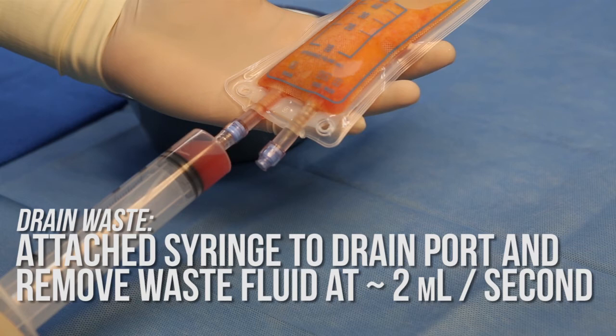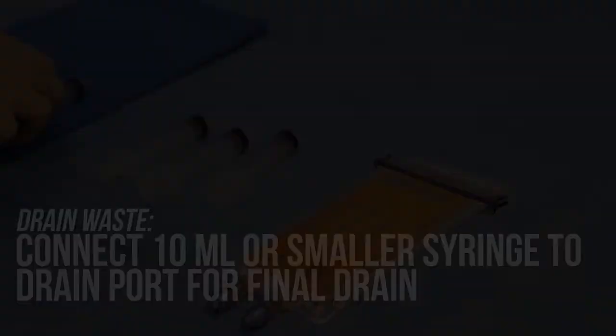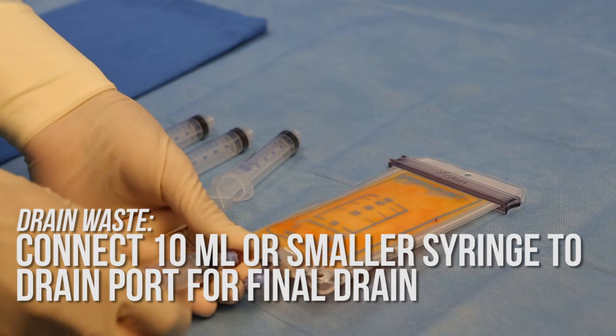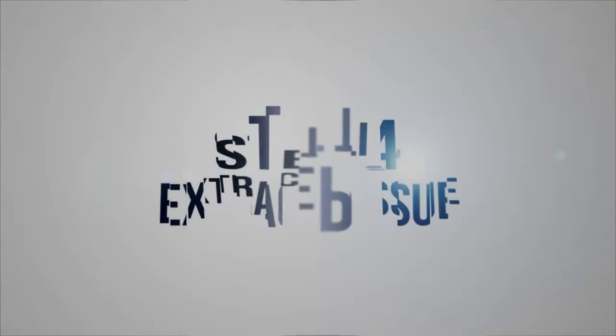The wash-drain cycle must be performed twice. This includes injecting 50 milliliters of lactated ringers, mixing for 15 seconds, allowing contents to separate for at least one minute, and slowly draining over the course of one minute. After the second wash-drain cycle, a 10 milliliter or smaller syringe is connected to the drain port again and the small amount of residual waste is taken out by pulling the plunger slowly. The same syringe is then inserted into the tissue wash port and approximately half a milliliter of trapped fluid is extracted and discarded.